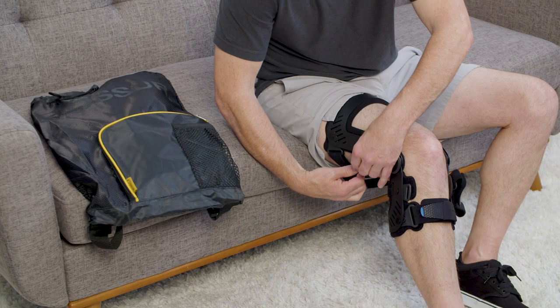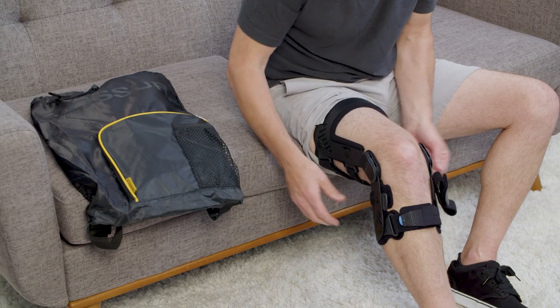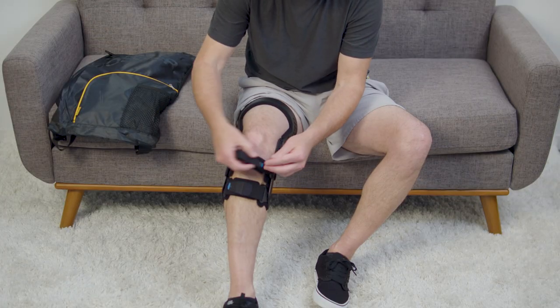Note: over-tightening the top two straps can cause the device to migrate. Fasten the upper shin strap.